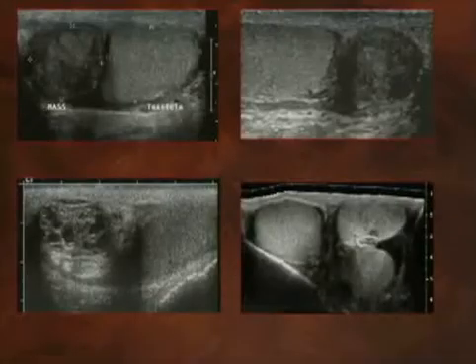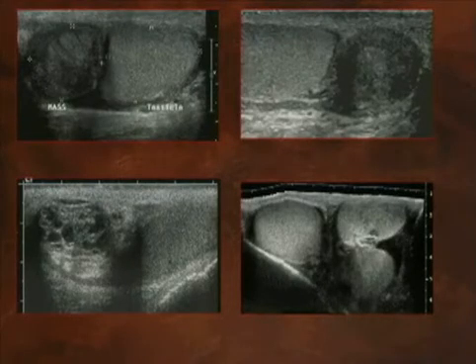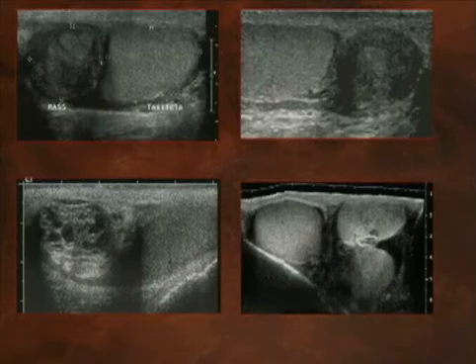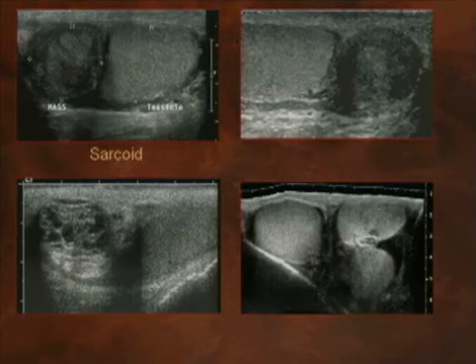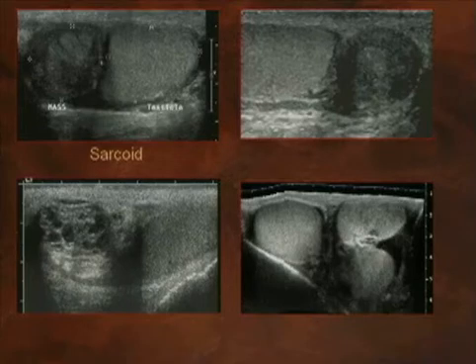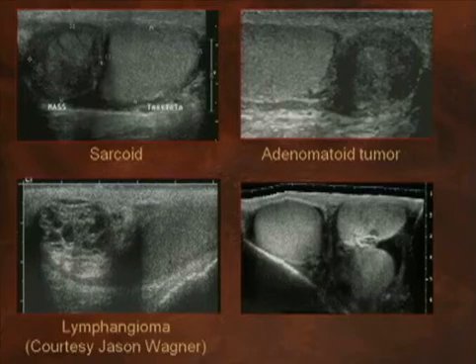Well, let's just look at a few other lesions before we talk about that. The lesion in the upper left-hand corner is a solid, heterogeneous hypoechoic mass superior to the testis. This was resected and shown to represent sarcoidosis. The lesion in the upper right-hand corner is a similar-appearing lesion but inferior to the testis, in the region of the epididymal tail. This was also resected and shown to represent an adenomatoid tumor.